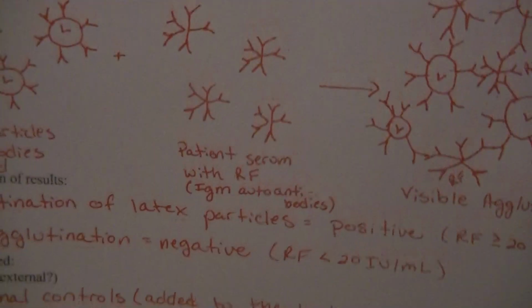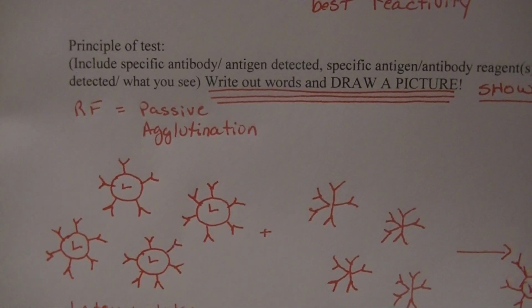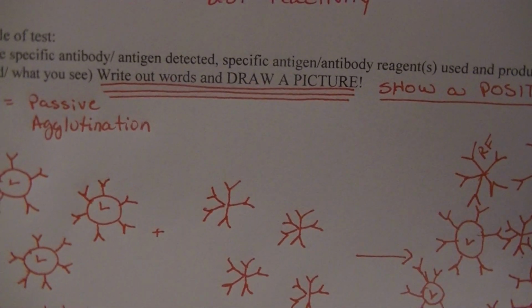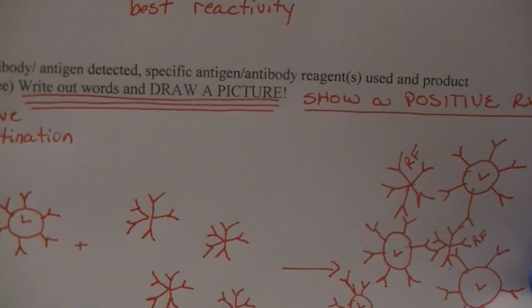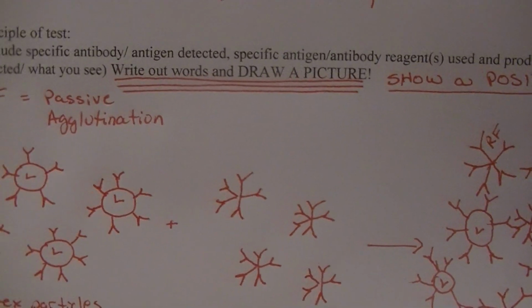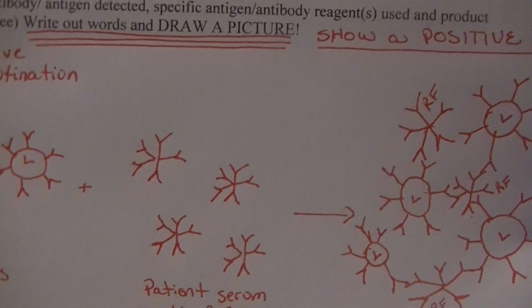Okay, so I saved the principle of tests for last because this is the one that students struggle with the most. When you do principle of test, I want you to include the specific antibody that we are using and the specific antigen we are using in the test system, both for the reagents and for the patient sample. Write it out with words and draw a picture showing me a positive reaction.